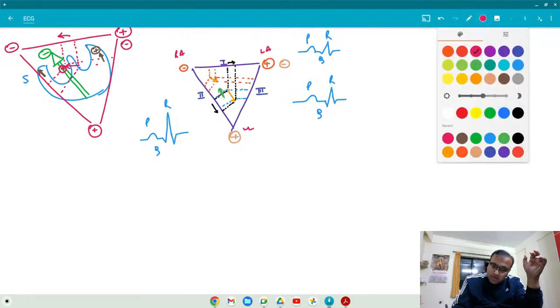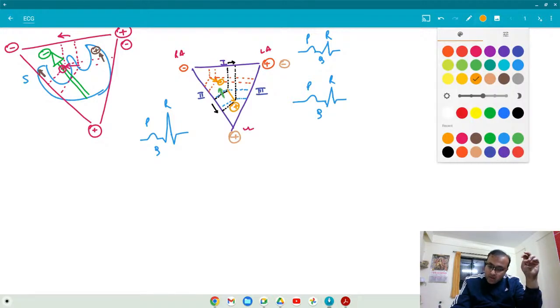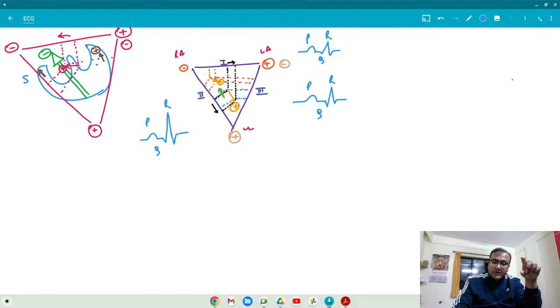So you tell me, what should be the type of deflection? So it should be positive deflection. Agreed? Agreed or not? Okay, Orchita, you have understood?